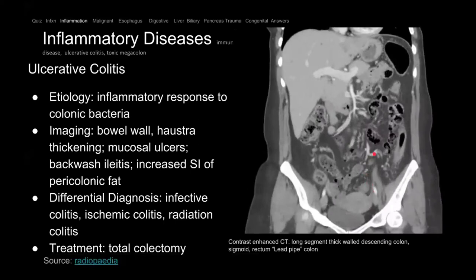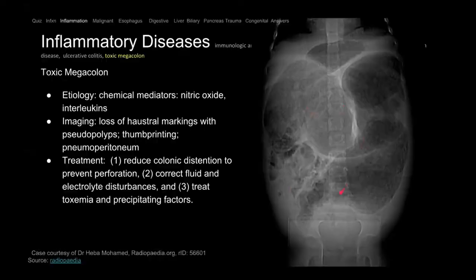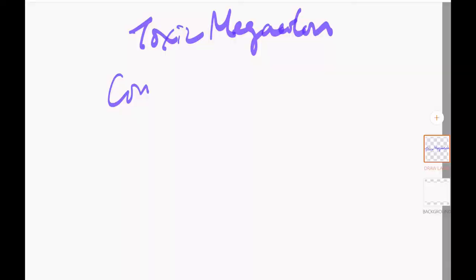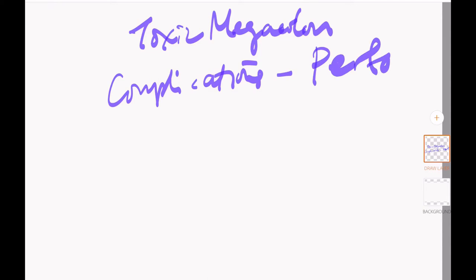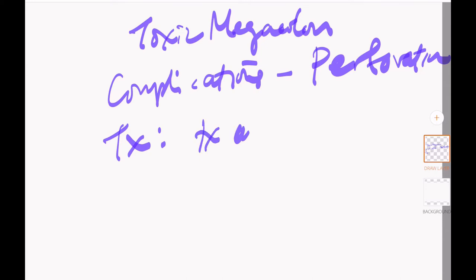On this radiograph, the colon is huge. There are many causes of toxic megacolon, including pseudomembranous colitis and Crohn's. It's critical to treat the underlying cause to prevent perforation.